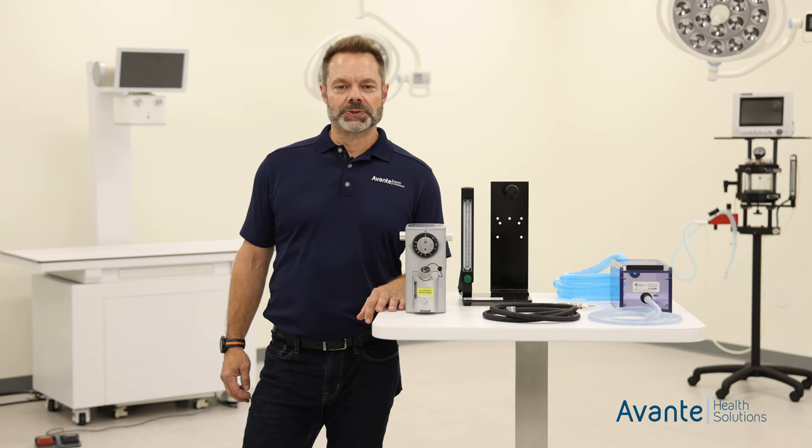Hi, Matt Cameron with Avante Health Solutions. Today we're going to go over our Compact Mini anesthesia machine, so let's go over the details.